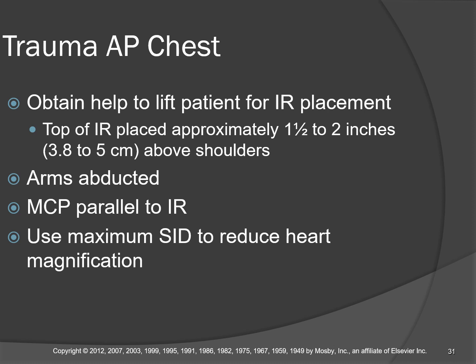Make sure the patient's square, they're not rotated. The shoulders are equidistant from the table surface or the image receptor surface, and the hips are also equidistant from the image receptor surface. Okay.